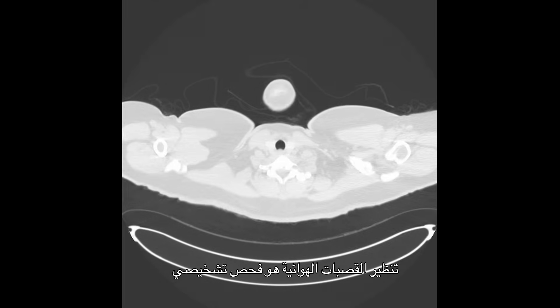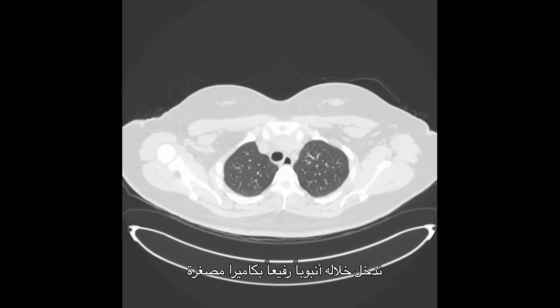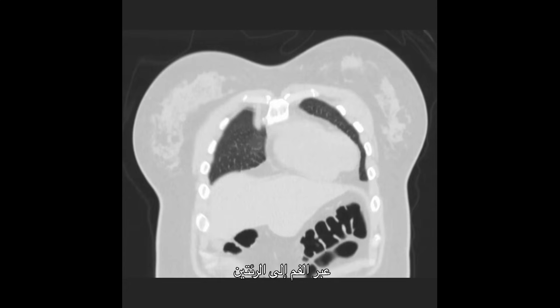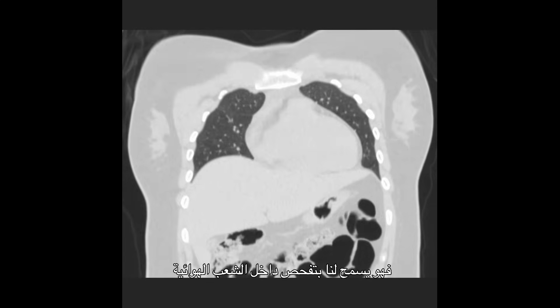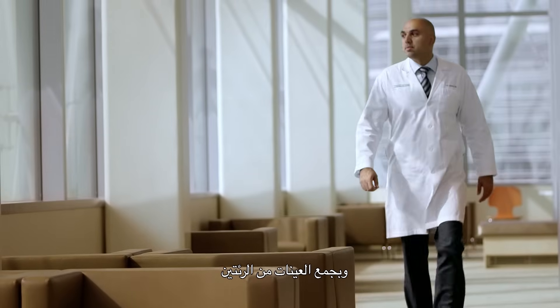A bronchoscopy is a diagnostic test where we insert a long thin tube with a mini camera on its tip through the mouth and into the airways of the lungs. It allows us to visually inspect the inside of the airways and also to collect samples from the lungs.